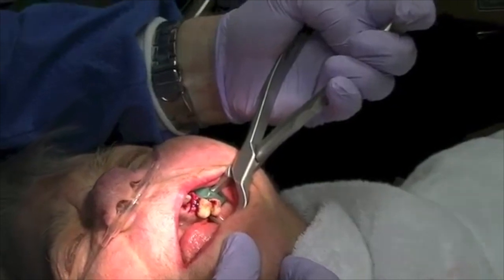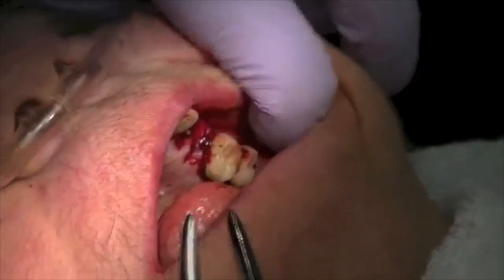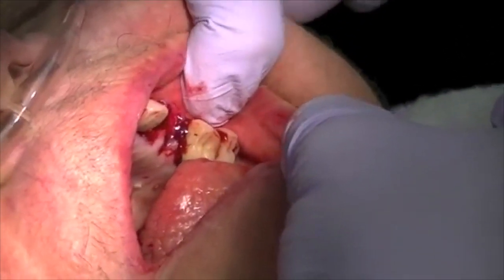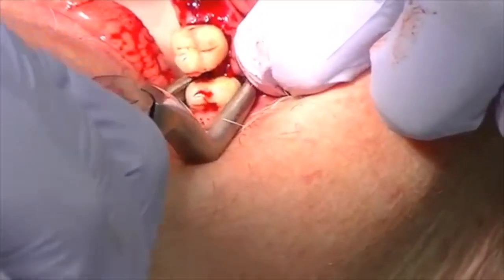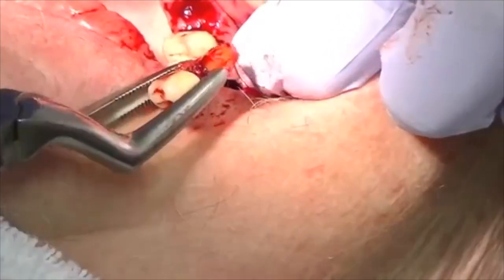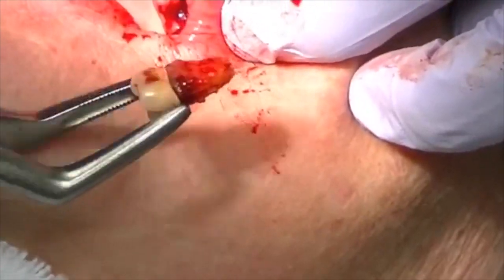You can see that tooth popped — a very badly decayed tooth, so we have to be a little careful. I want you to see on the video that the tooth actually came out and up out of the socket. Taking my tooth delivery instrument and rotating, we're able to remove that molar intact, maintaining that facial bone very nicely.